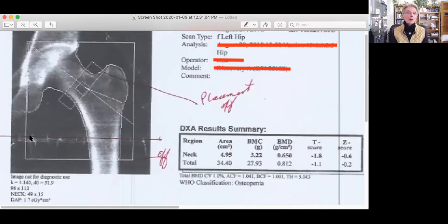And the reporting doctor, if they don't catch it, and I'm telling you quite often they don't, and a lot of times these facilities are put on automatic, nobody physically looks at them. And I would say it's very important for them to be checked. So if the next person who does the bone density does it correctly, then what's going to happen is it's going to show that loss. Or the reverse can be true.